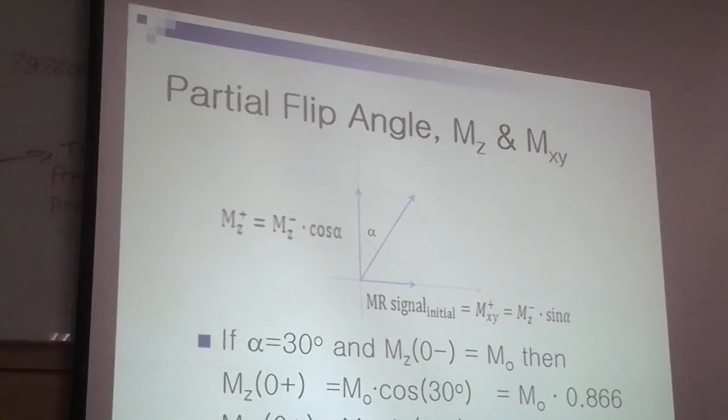For the tissue, for example, it depends on the machine, the magnetic field, spin density, sensitivity of the RF coil, and temperature. So the machine already fixes M0; it is a constant value for the imaging condition.